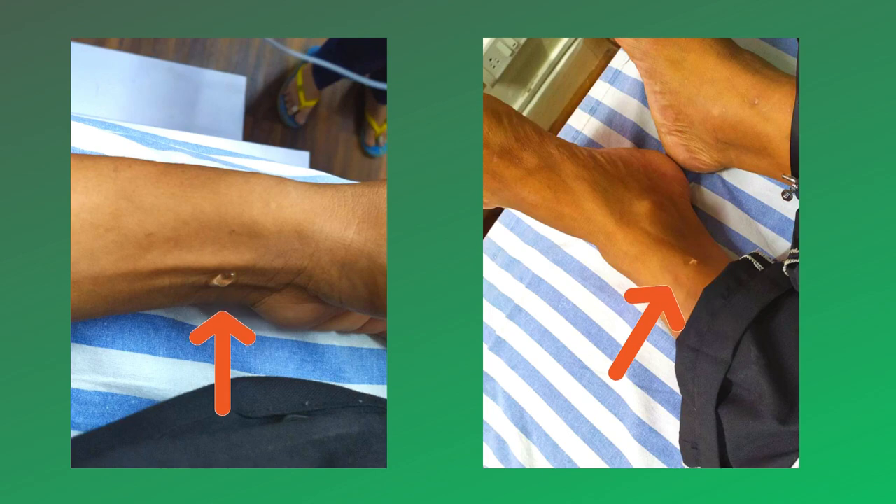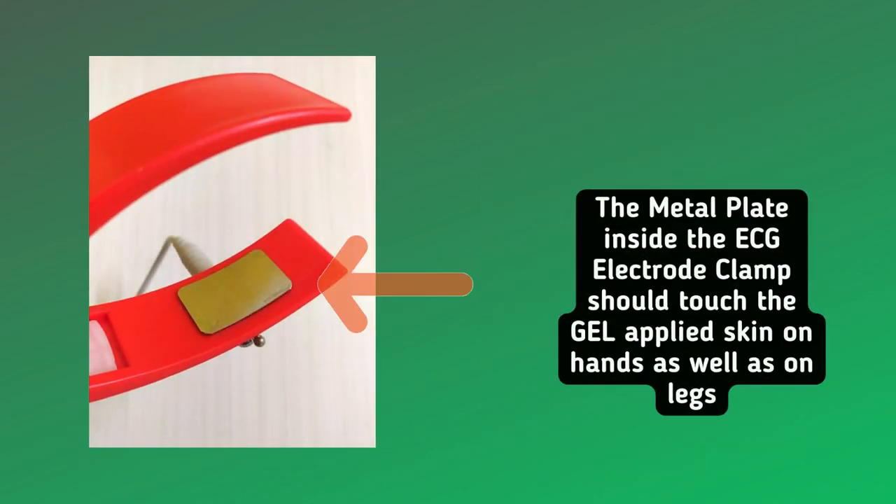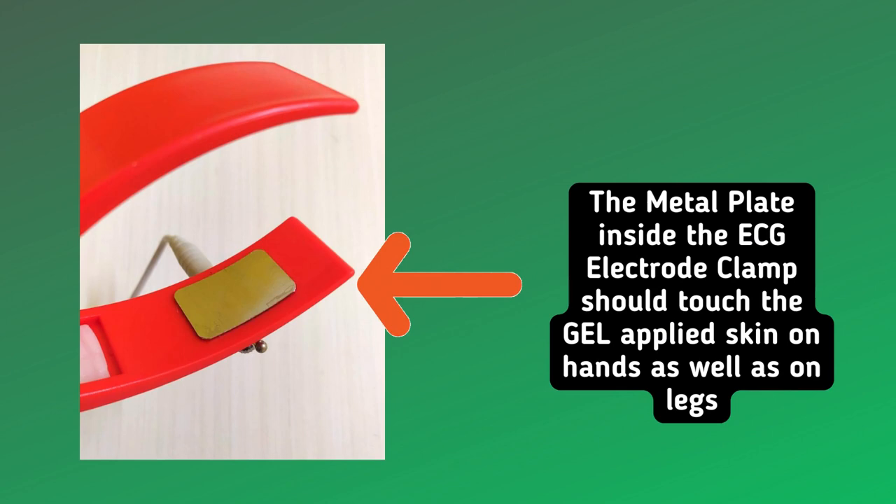The metal plate inside the ECG electrode clamp should touch the gel-applied skin on both hands as well as on legs.